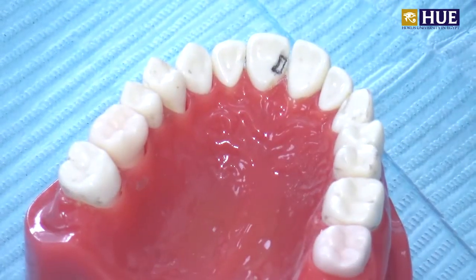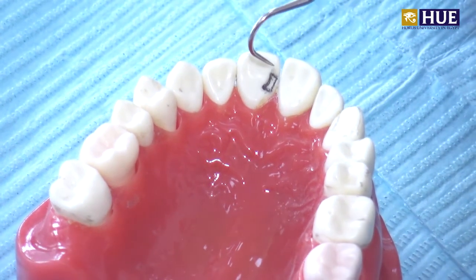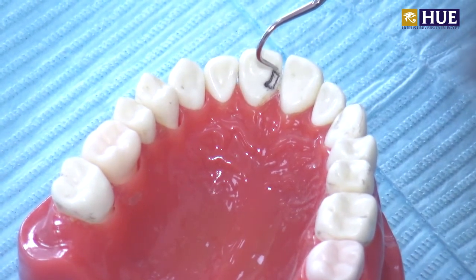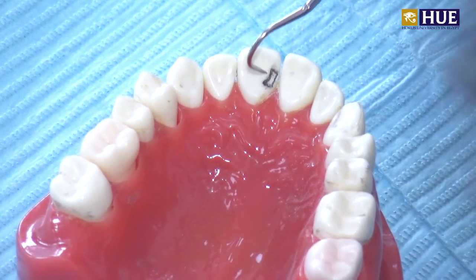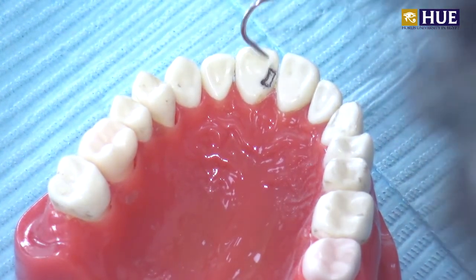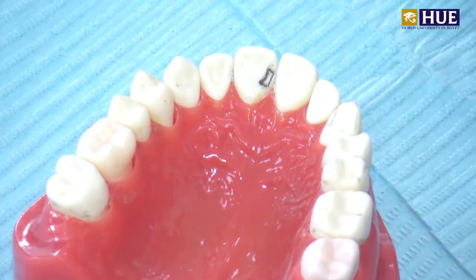This is the final design of the conventional class 3 cavity, the GV Black cavity, with features as mentioned: incisal, gingival, axial and labial walls, with a bevel all around the margin and the two retentive grooves at the axiogingival and axioincisal corners. Thank you.